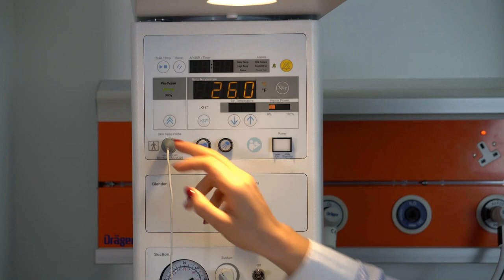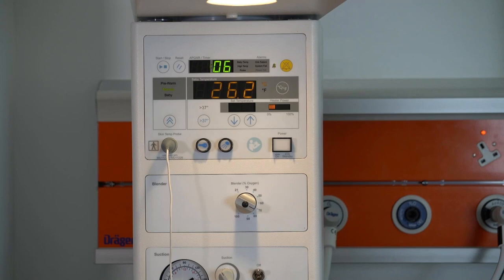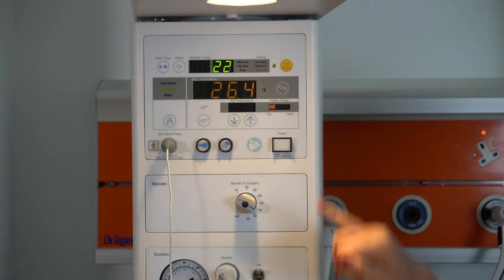So when your baby is delivered, you can start by pressing the start, and you have the timer that counts the first 60 seconds. And then basically, it is the Apgar timer, so it will count until 10 minutes. The device will give you a sound notification at 1 minute, at 5 minutes, and at 10 minutes. So your timer will be running, and we're going to listen to 1 minute.